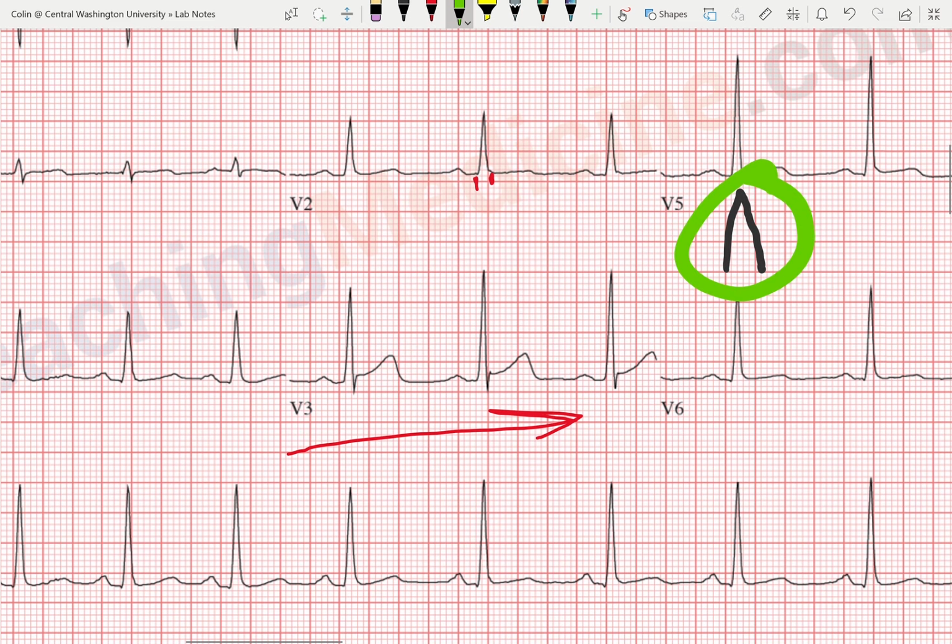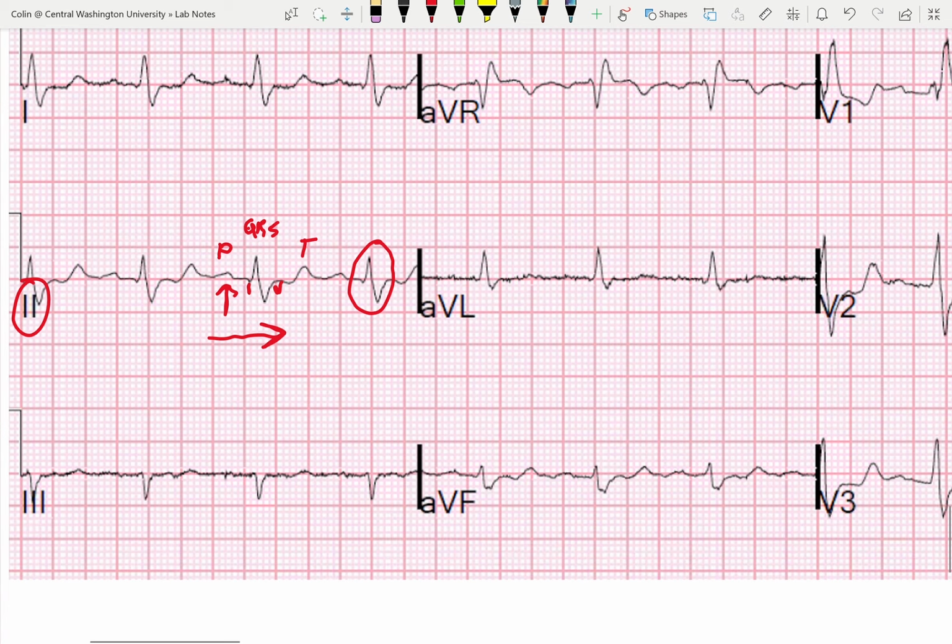As a real bonus here, because we were talking about why we call it the QRS complex, let's take a look at the one that we have circled here. Ask yourselves, what waves do I see? Is there a Q wave, an R wave, and an S wave? Is there just a Q wave? Is there just an S wave? So take a second, look at it. What do you think? What waves can we see there? If you need more time, just pause the video because spoilers.